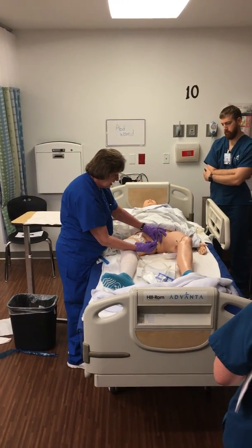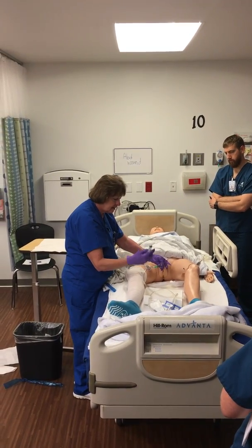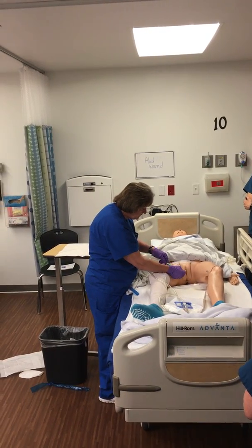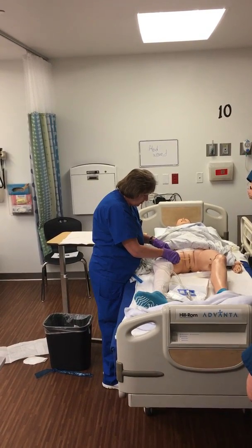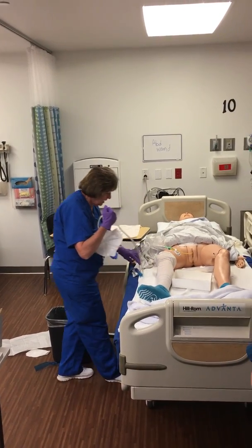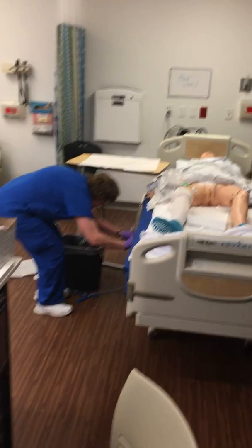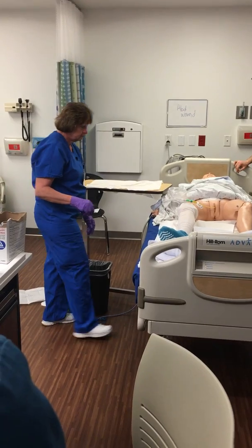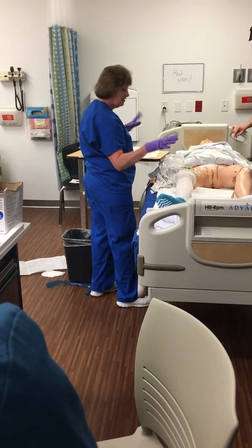Now I have to fill the balloon. I have to put constant pressure on this plunger, otherwise it'll come back right out at me. The balloon is in her bladder — that's why we advance it two to three more inches after we see urine. Then while holding down on this plunger, I'm going to come down here and disconnect. Then I need to secure this to the catheter using whatever device they have. We just tape it, or you might use one of these on the mannequins. Then I'm going to secure this to a non-movable part of the bed — we actually have hooks on these beds, but not the bed rail.